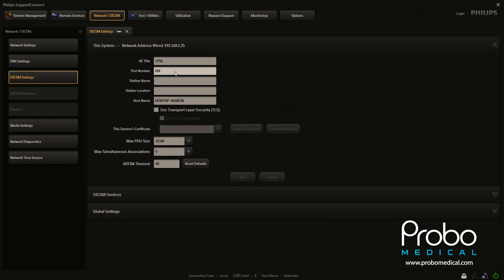This unit already has an AE title, a port number, and you want to go ahead and enter those. If your unit has never been on a network before, it definitely needs an AE title and a port number. You can add a station name if you would like. That's completely optional.